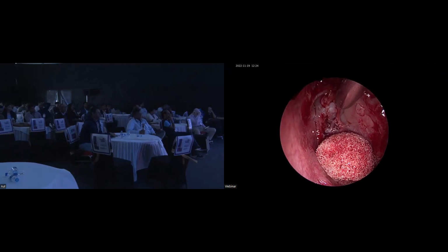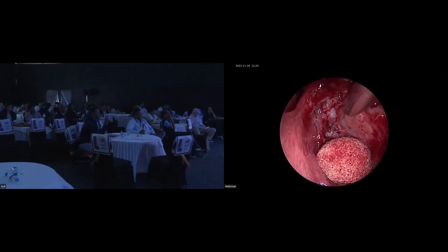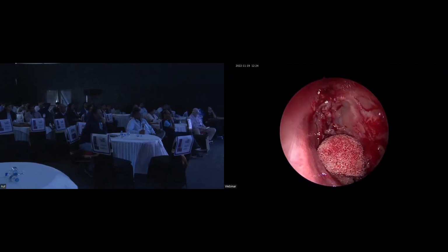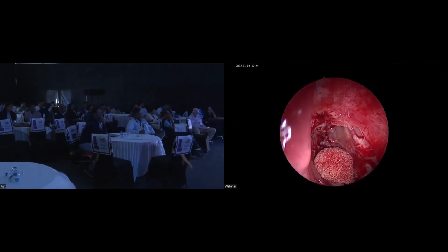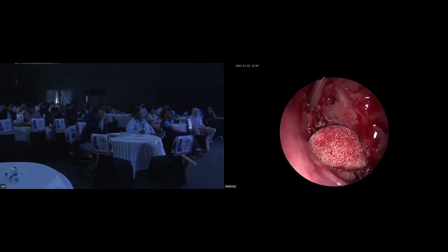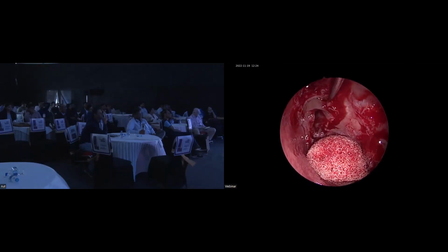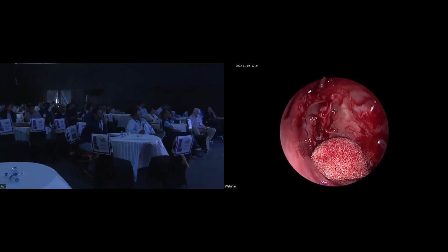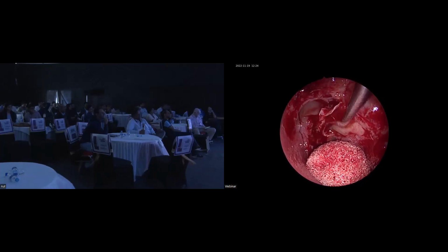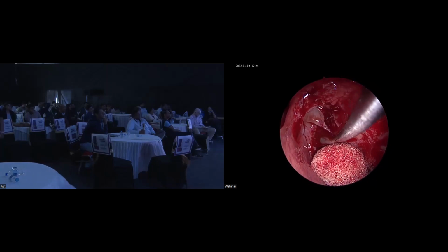So here you are seeing the upper part of the uncinate. Upper forceps, please. Ball point. This is the attachment of the uncinate and this is the terminal recess. Yes. So this is your upper part of the uncinate I'm removing. Uncapping the egg. Yes. So you can see that coming out.